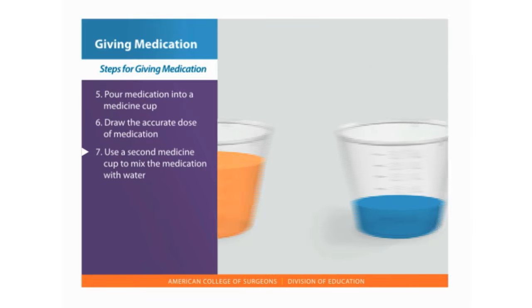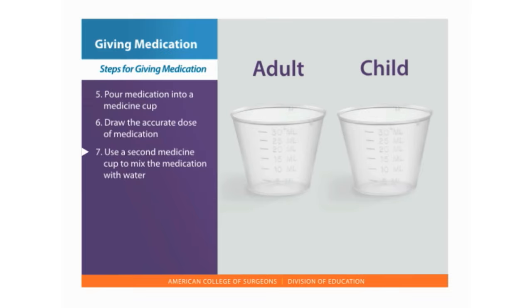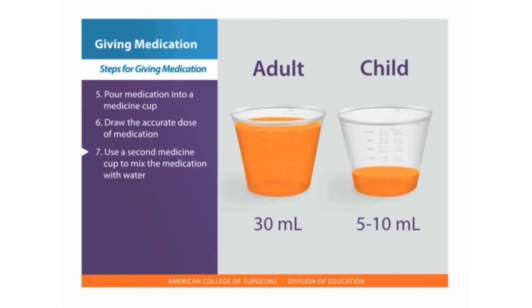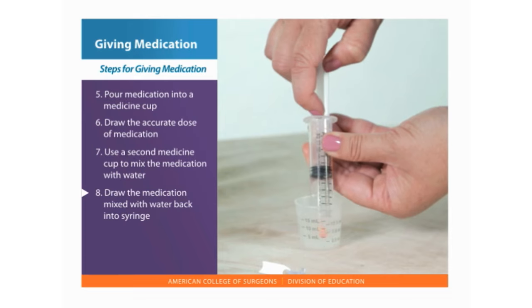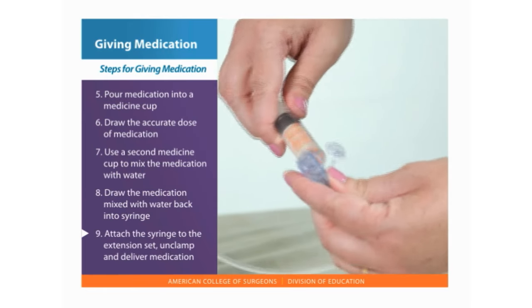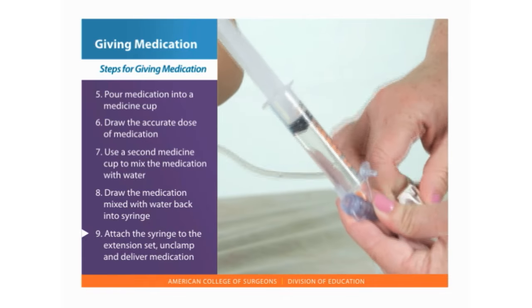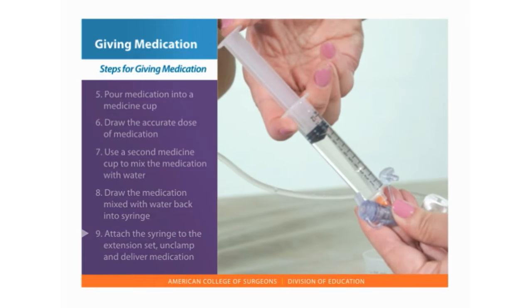7. Use a second medicine cup to mix the medication with water. Mix medications with 30 milliliters for an adult and 5 to 10 milliliters for a child unless fluids are restricted. 8. Draw the medication mixed with water back up into the syringe. 9. Attach the syringe to the feeding extension set or feeding tube, unclamp, and deliver the medication.